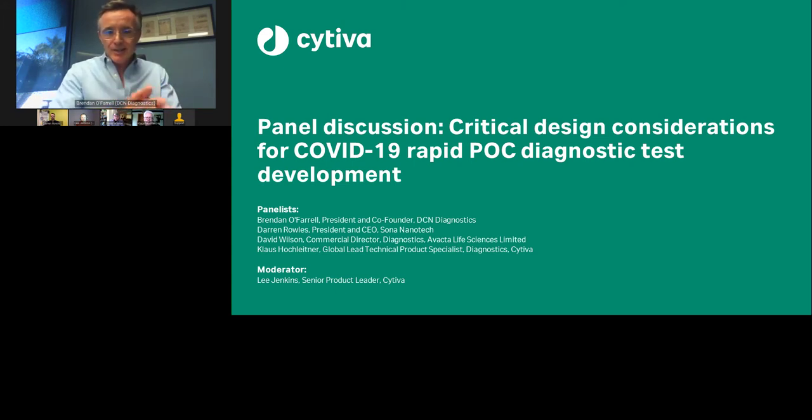So we are drawing a line in that development process at a point where we haven't, by definition, under any circumstances, demonstrated that our products are highly reproducible and highly scalable at the level at which we're going to have to manufacture them. So there's inherent risk in that process. So what we have to do as development organizations and manufacturing organizations is try to pull back as much of that risk as we can through the proper application of development methodologies, and understanding that even after we have released these products to market in this specific instance, development continues. Right. There's not a defined line here that says this product is done.